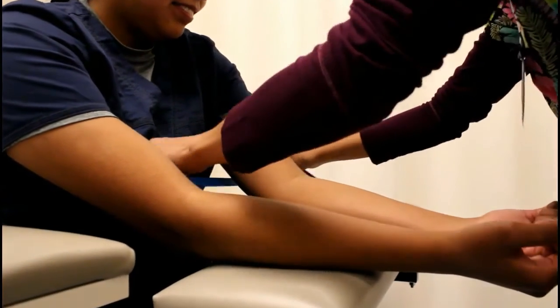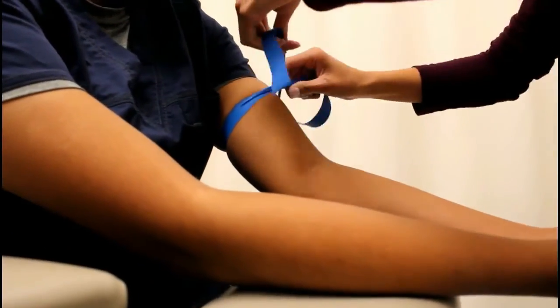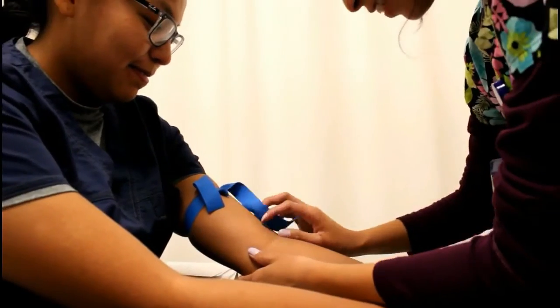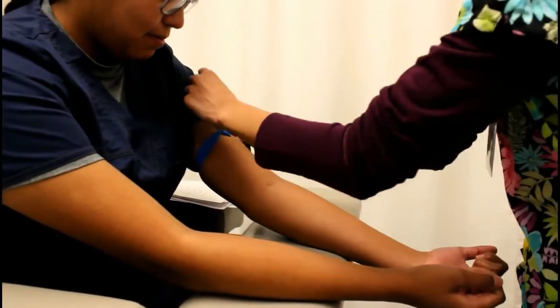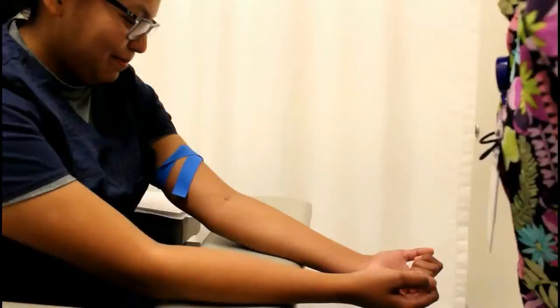Position the latex tourniquet 3 to 4 inches above the venipuncture site. Grasp both sides of the tourniquet and, while maintaining tension, cross the tourniquet over the patient's arm. A properly applied tourniquet will have the ends pointing up away from the venipuncture site. Once you have selected your preferred vein, pull the end of the loop to release the tourniquet with one hand, and the tourniquet should only be on for 1 minute.